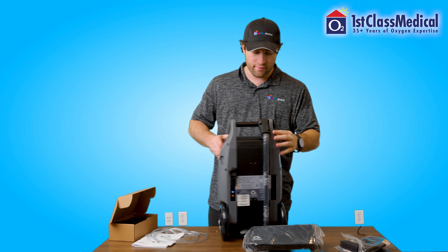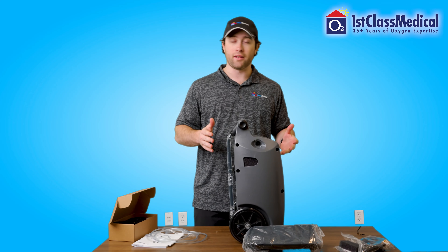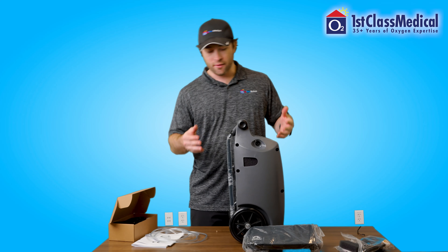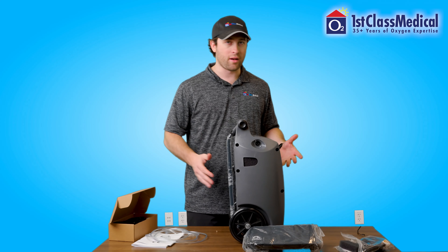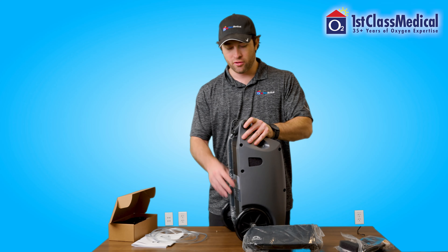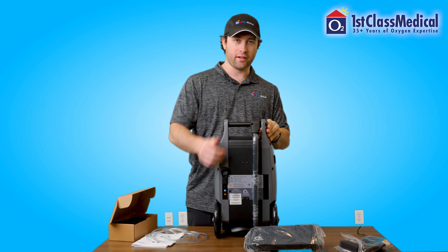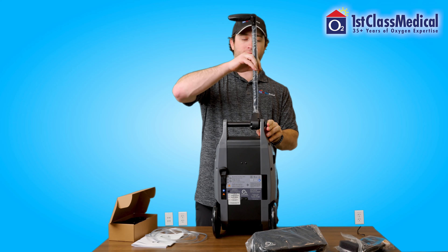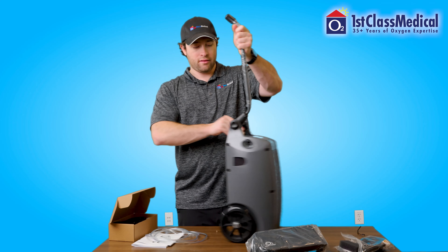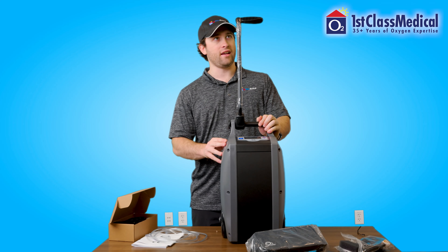You will also have the cart. The nice part with this OxLife Independence is that setting it up is very simple — it was just that battery. The cart's already on it. You don't have to worry about a bag. All you have to do is push in this little button here, and then this cart will come up and click into place. Cart's already attached.